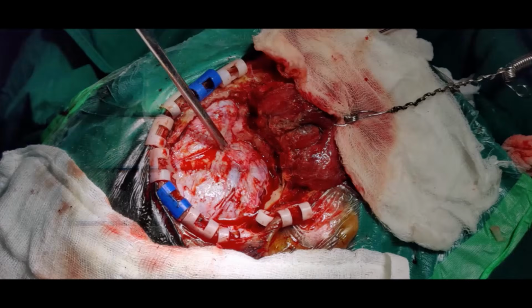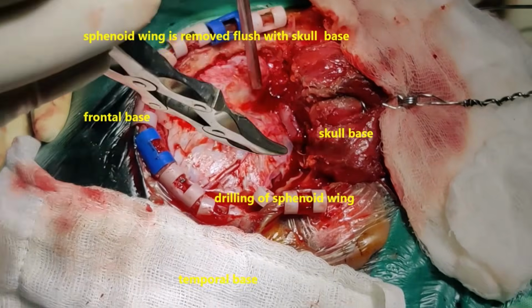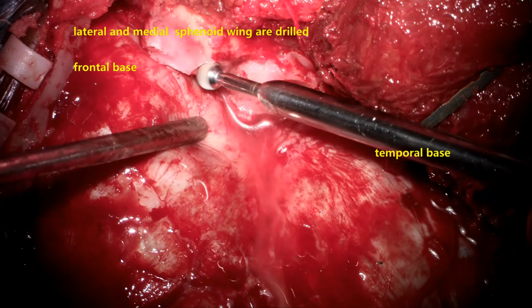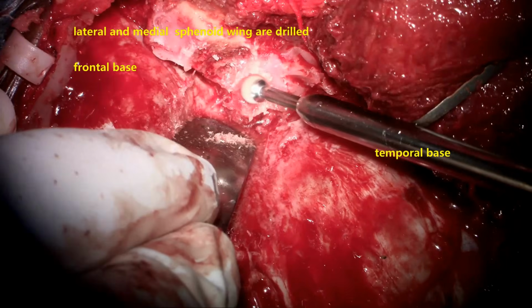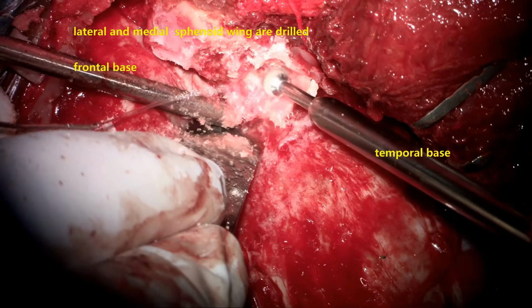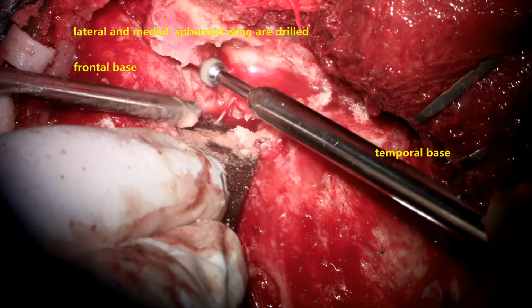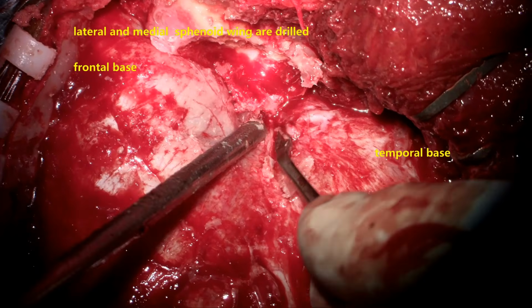Bone is taken out. The next important step is to decompress or drill the medial and lateral sphenoid wings. This process helps in creating a good amount of surgical space in anterior and mid-skull base pathologies and deep-seated lesions. These are the steps of drilling or decompression of the lateral sphenoid wing, flush with the anterior and mid-skull base.